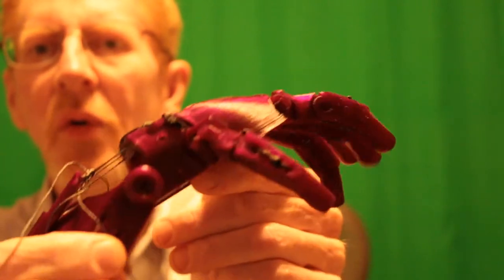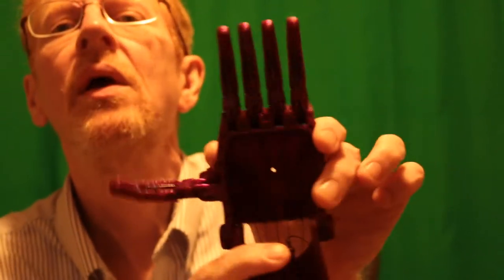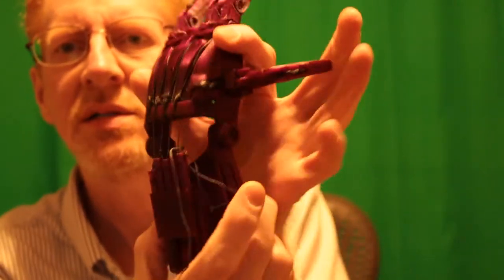Just to demonstrate real quick. I've got the fingers where they meet here on purpose. This one goes in a little further, also on purpose. The back side looks okay.